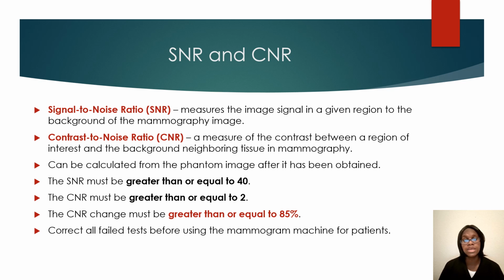The SNR must be greater than or equal to 40. The CNR must be greater than or equal to 2. The CNR change must be greater than or equal to 85%. Make sure that you correct any failed tests before the machine is used for patients.